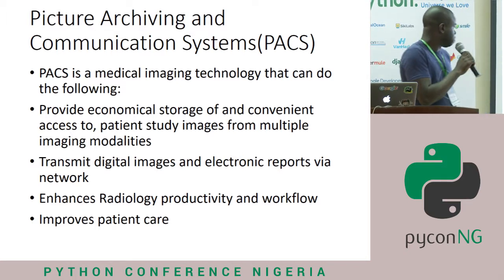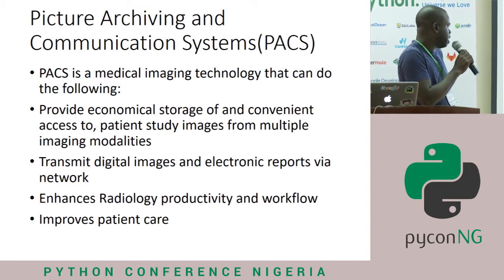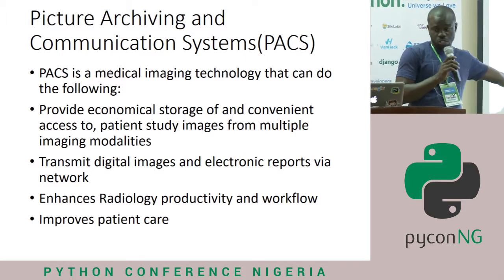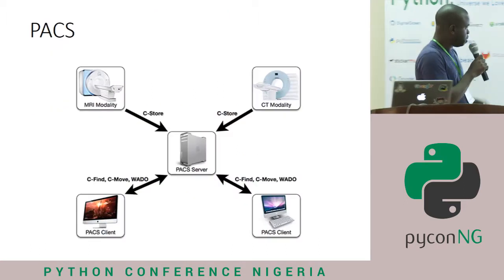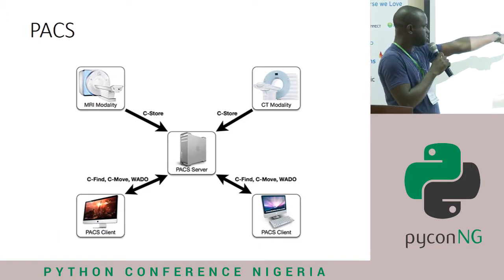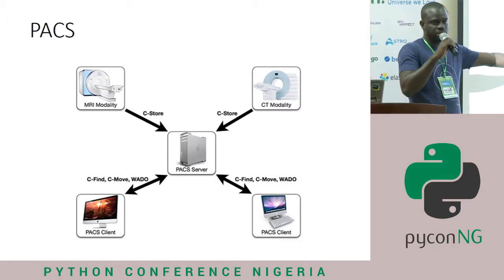and then it allows for transmission and electronic reports via network. It enhances the productivity of the modality, the MRI modality, the CT modality, but at the center of it all is a server that we call the PACS.